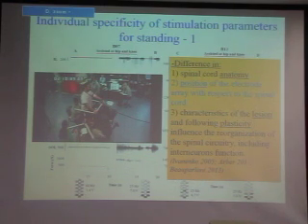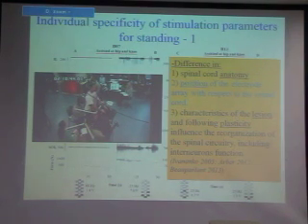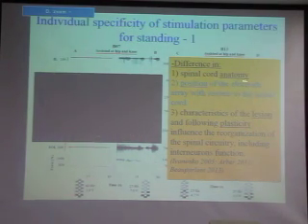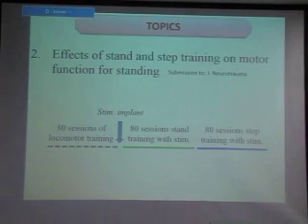And this can be due to different reasons. Probably these are 3 of them. One is the actual individual differences in spinal cord anatomy, and more importantly, the position of the electrode array with respect to the actual spinal cord. And also because after injury, these lumbosacral circuits undergo plasticity, and this can be different, given the motor experience these patients had, or because of the type of the lesion. So these are some of the challenges that we face.